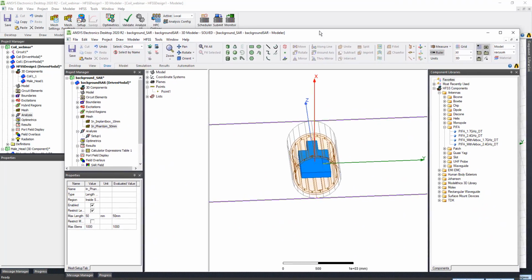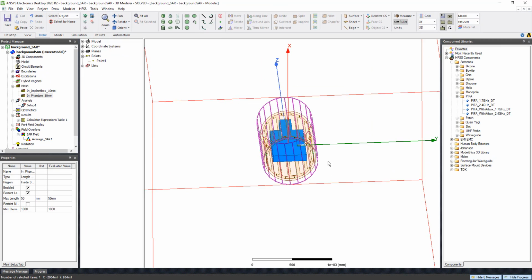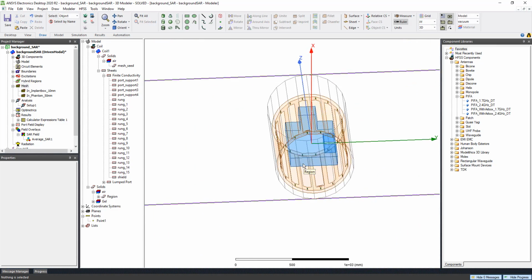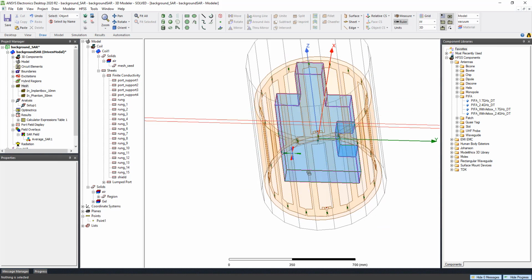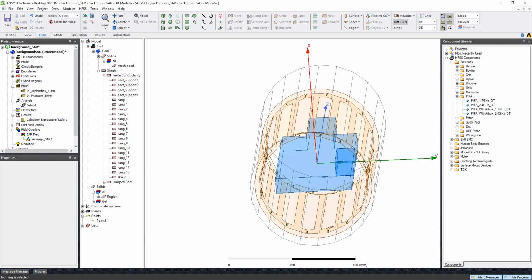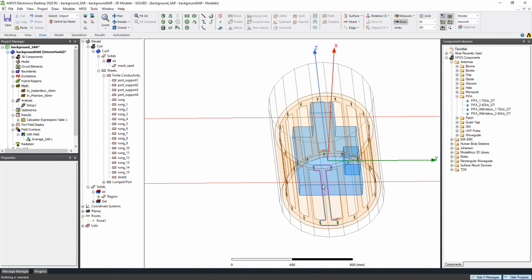So yeah, I have a soft model. This is what I have here. I'm just using a gel to simplify the simulation time here, because the human head has some curvature and is quite a complex geometry. It has a nose and eyes, so it might take a little bit longer. Here we have the gel, and it's already simulated.